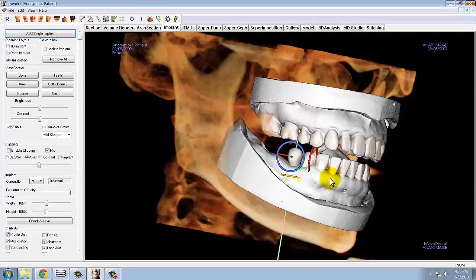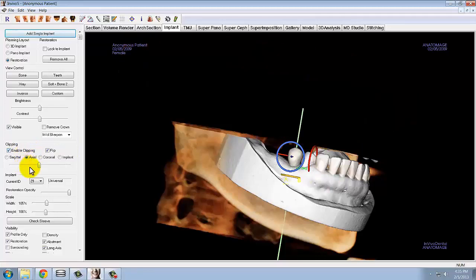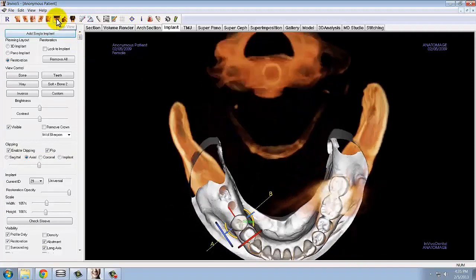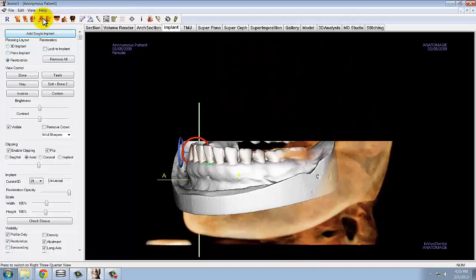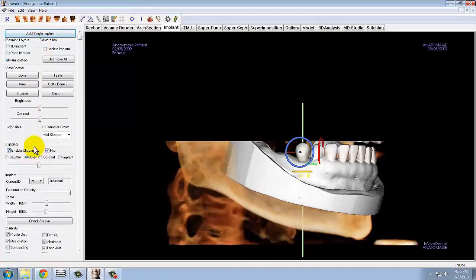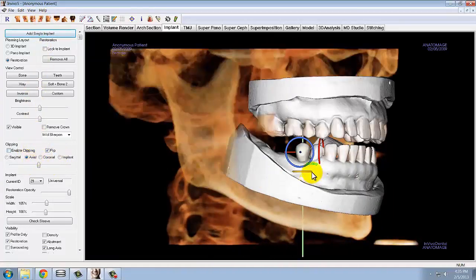If you would like to go back to this clipped occlusal view, enable clipping in the toolbar, select either the top view or bottom view preset orientation from the toolbar depending on whether the implant is on the mandible or maxilla, and scroll accordingly to get the appropriate amount of clipping. You can also view the restoration and occlusion with the opposing tooth by examining a more lateral view. If necessary, you can use the clipping option to clip the volumes so you can see more easily.